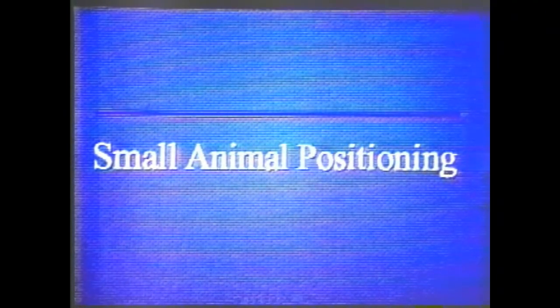Always think ahead and get everything ready, almost to the point of following a checklist prior to the actual exposure. You must consider things such as: number 1, measuring the animal correctly and setting the machine for the proper exposure for the thickness and body part of the animal.